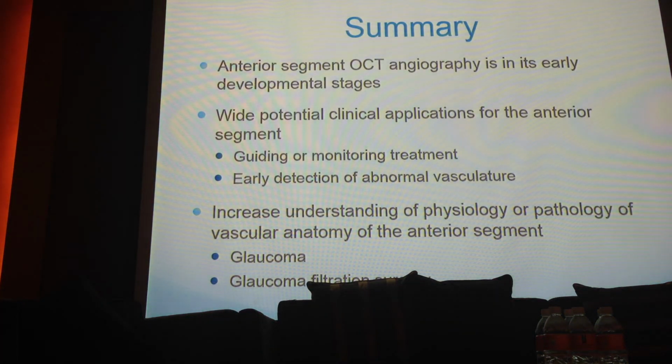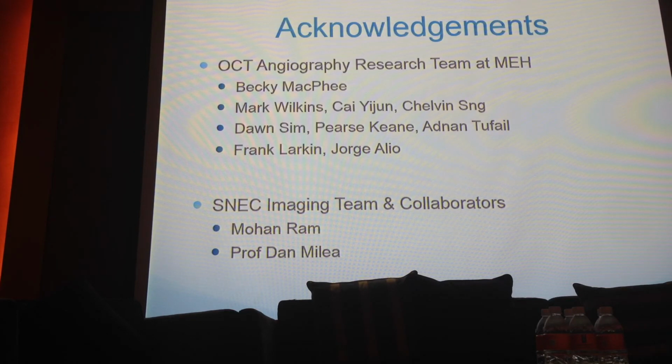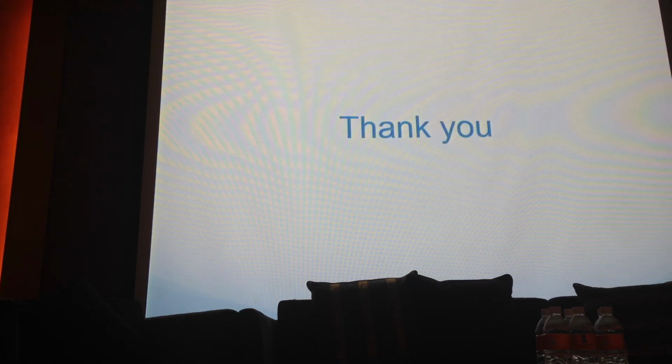So yeah, pretty fun stuff for the anterior segment, may be able to help us in our daily practice and hopefully extend that. We're looking at the effect of glaucoma and glaucoma filtration surgery in the anterior segment as well. And we also have a series of scleritis and PUK patients that we're going to publish on, but we don't really have time to. Same people I want to acknowledge.